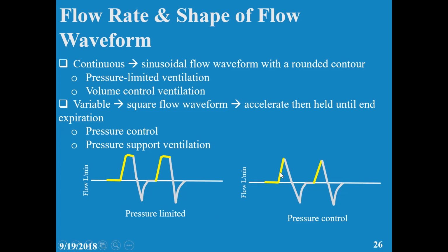Okay, so remember, while you can see here, it goes up and down, never stays. This is pressure control. This is volume control, pressure limit.